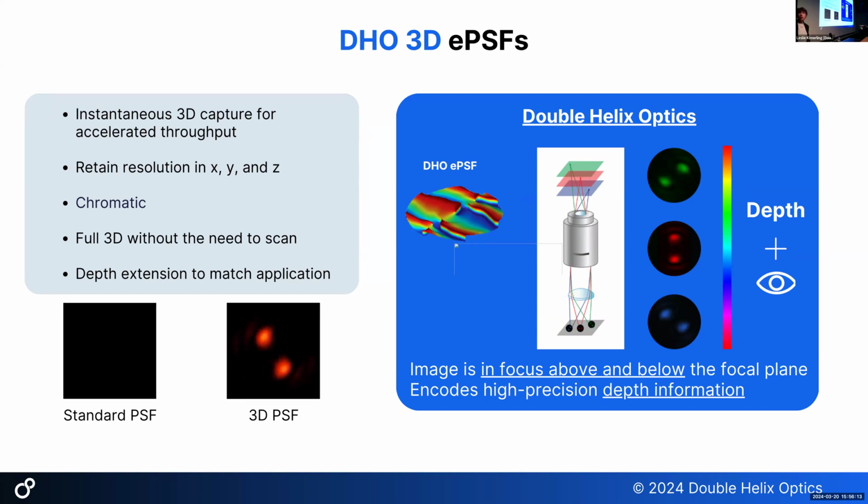When you use your faceplate, do you rotate? Do you ever rotate? It's static? Can you speak up a little, G, so we can hear the question? I was asking whether they rotate the faceplate when they use it. So it's completely static. It's aligned. We align it, okay, so it's aligned with your system.